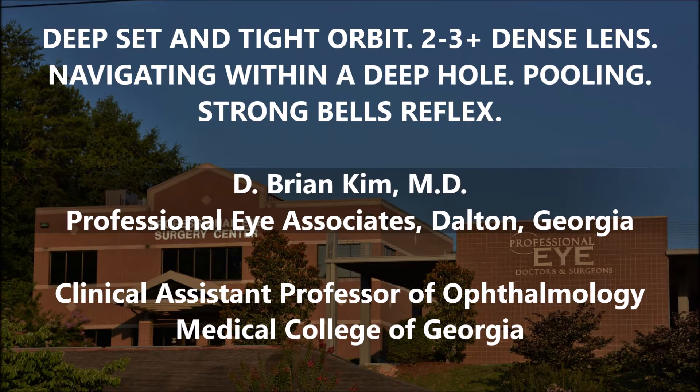This is the left eye, and for me in general, the left eye is a little bit more challenging, especially with the deep set eye, because with my chopper in my left hand, I'm closer towards the patient's cheek area. You'll see how I'm able to navigate through and deal with this challenging case.